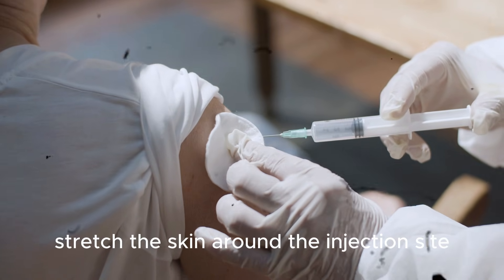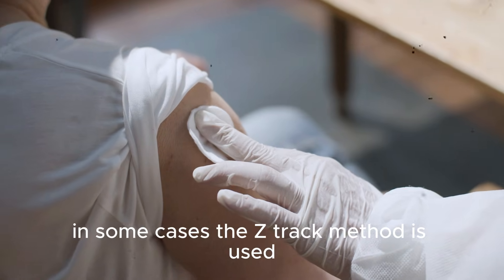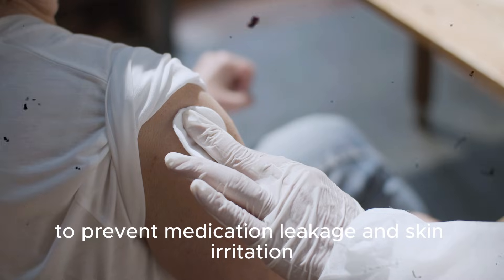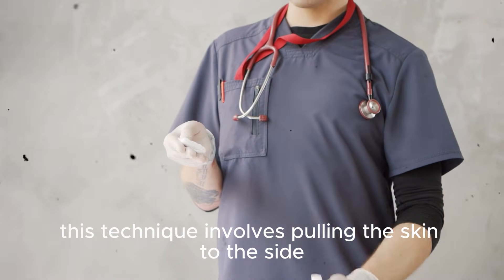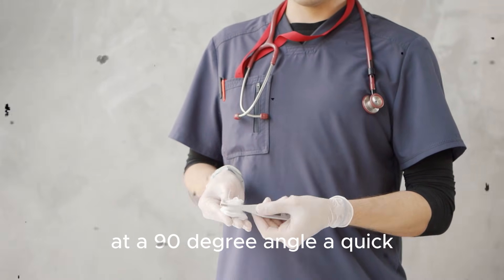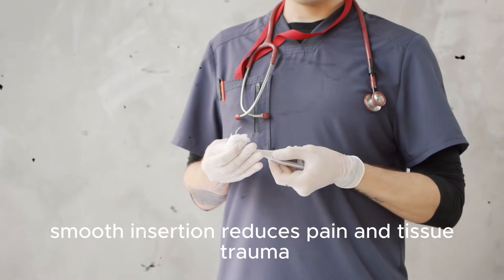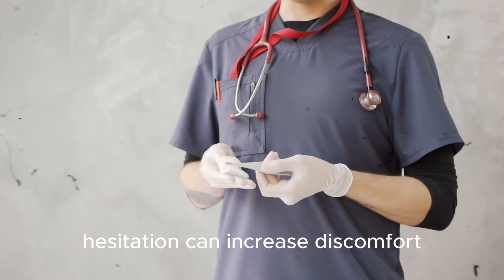Hold the syringe firmly like a dart — this grip gives better control and confidence. Stretch the skin around the injection site with your non-dominant hand. In some cases, the Z-track method is used to prevent medication leakage and skin irritation; this technique involves pulling the skin to the side before inserting the needle. Insert the needle quickly and confidently at a 90-degree angle, as a quick, smooth insertion reduces pain and tissue trauma — hesitation can increase discomfort.